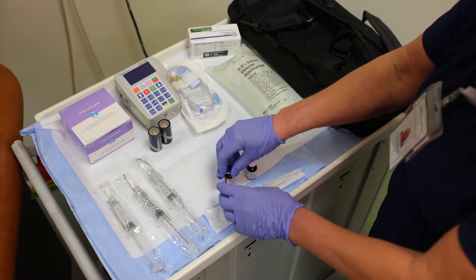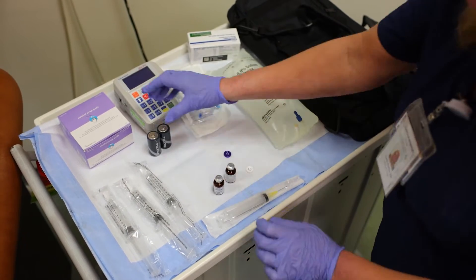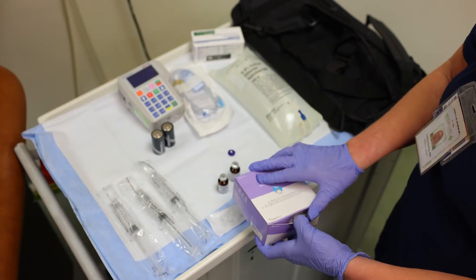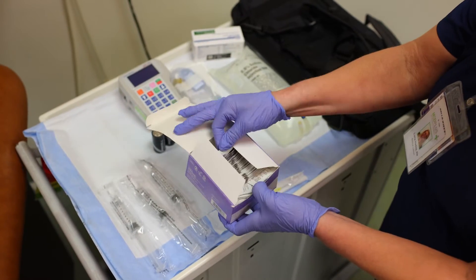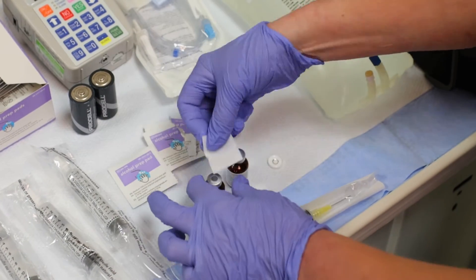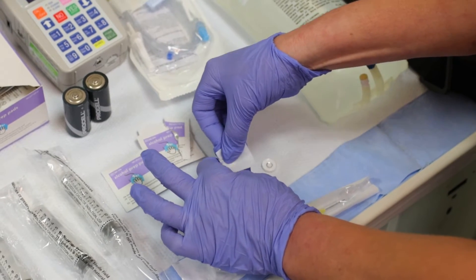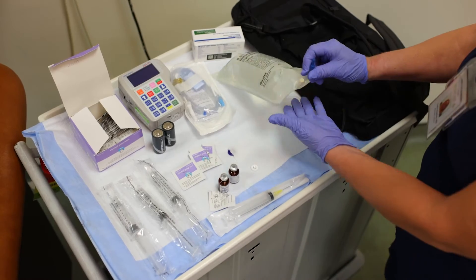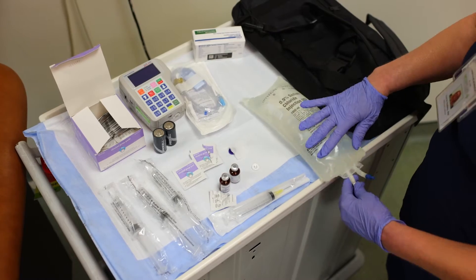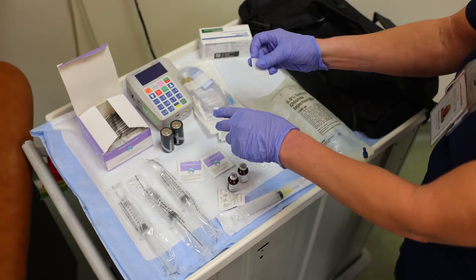You're going to take the cap off and get your alcohol. You're going to clean the tops of your vitamins. This is where you're going to inject the vitamins, right here, so you would clean that area also.